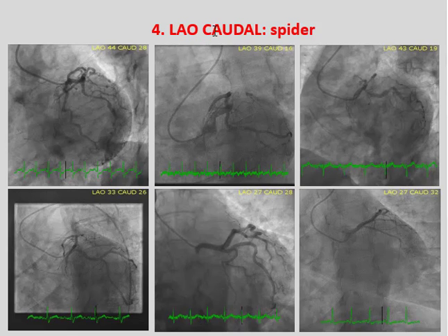Caudal views tend to look at the heart from below, and if you have a little model of the heart and you turn it upside down, that's what it looks like. Remember, the LAD is curving along the seam of that football down there. LAD is partly occluded, but it's curving down there with the circumflex coming off this branch. LAD there and circumflex there.